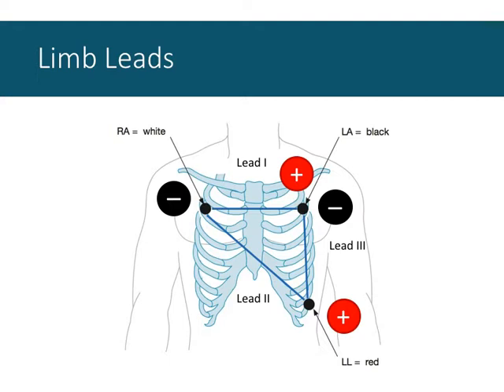And I know last class I mentioned that you'll often use this as a ground, and you can. If you're only concerned about the lead 2, this left arm electrode can be a ground if it's out of the way and usually over bone. In this configuration, where we're collecting information not only on the lead 2 axis, but also for lead 1 and lead 3, the ground would be on the lower right hip, usually on the iliac crest, way out of the way. Not to be confusing.